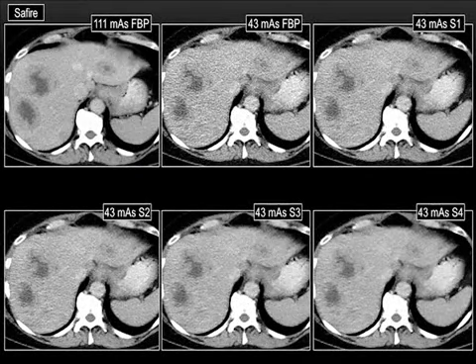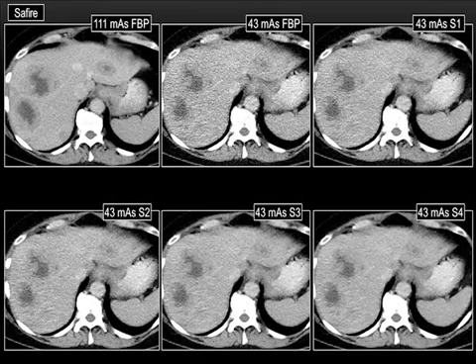This patient was scanned with 110 mAs and then 40 mAs, reconstructed with filtered back projection. You have multiple liver mets. I don't know whether you can see, there is a central necrotic region, and there is a peripheral rim at this dose level. And even in this lesion, you see a peripheral rim over here. And when we reconstruct this raw data with Sapphire settings, even though the noise has gone down in the liver, it doesn't bring that rim back.